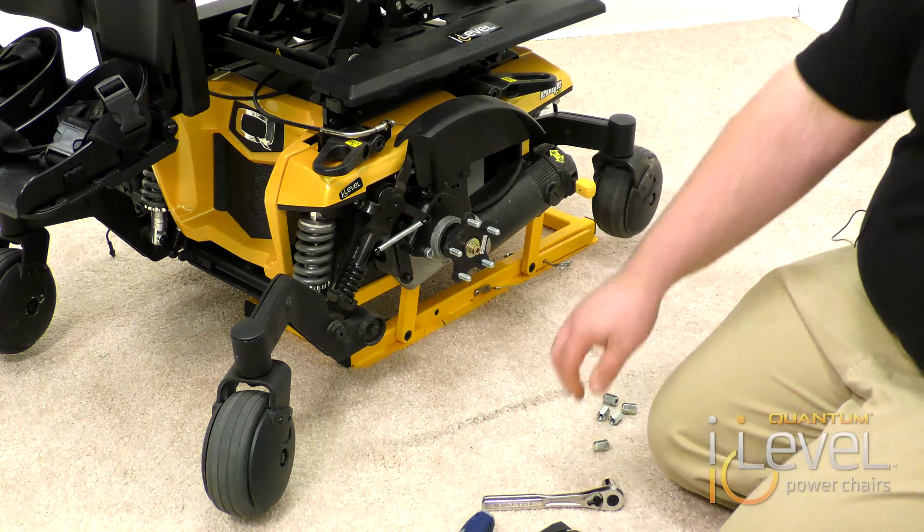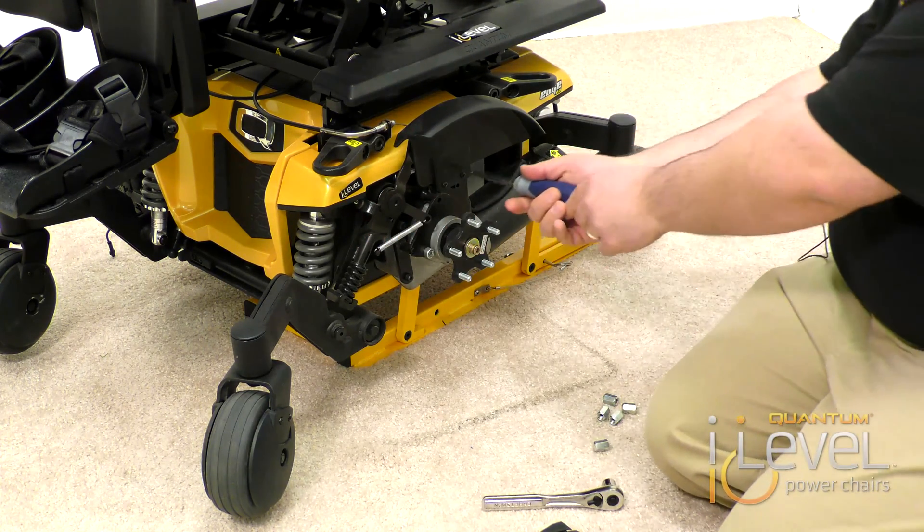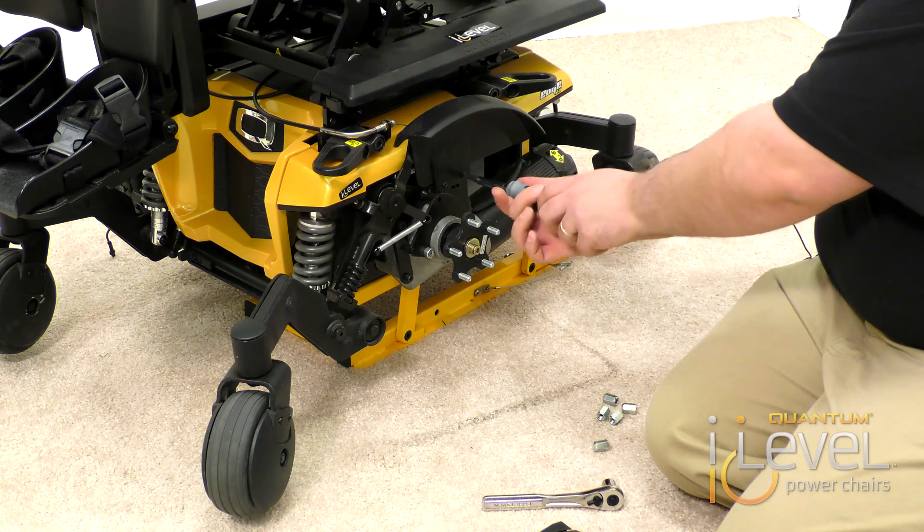Once your drive wheel is off, take a Phillips head screwdriver and we have to remove the existing fender.